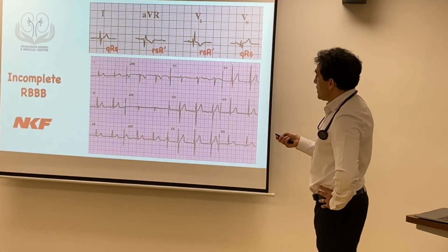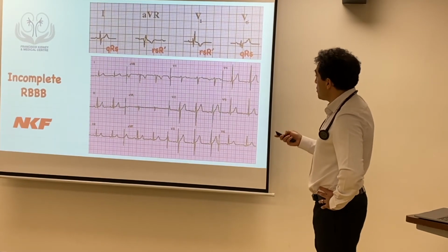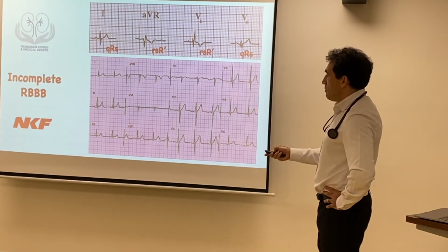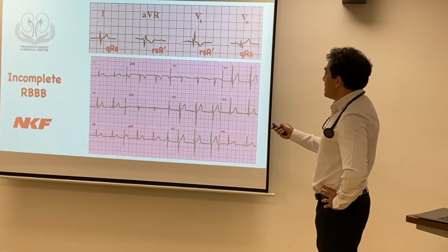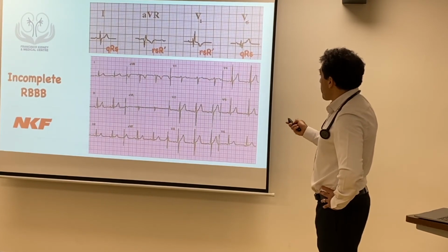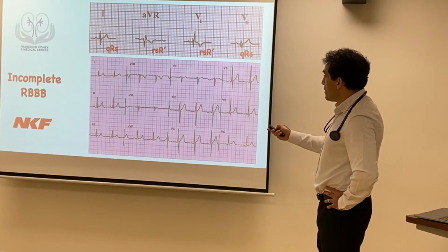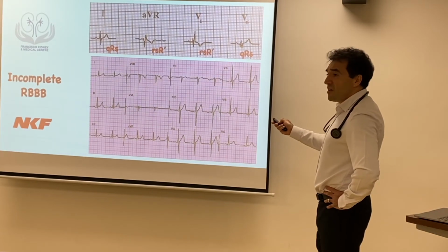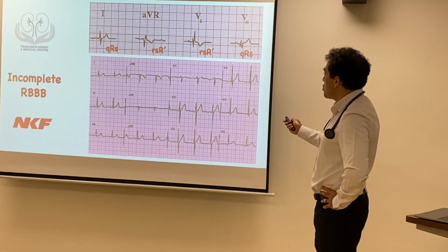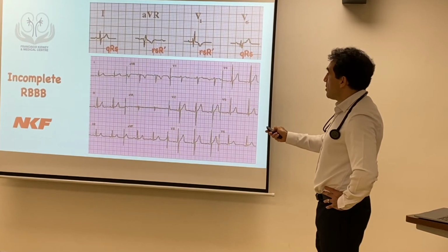This is basically incomplete right bundle branch block, where you have heard those terms. So meaning the conduction through the bundle going through the ventricle is delayed for whatever reason, maybe a pathology, etc. Then the QRS are looking funny. The conduction is a little more difficult over there, so it takes longer, so that's why it's a little bit prolonged, and it gets a funny shape.